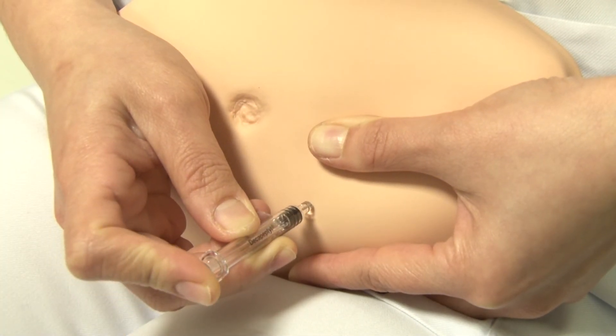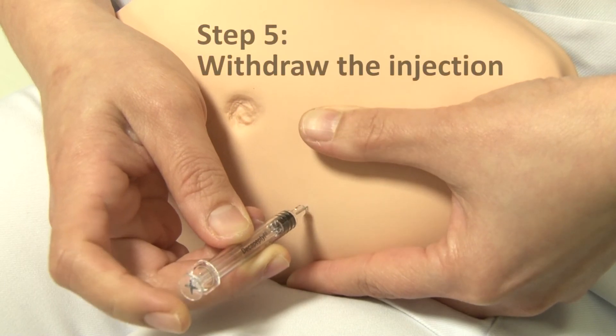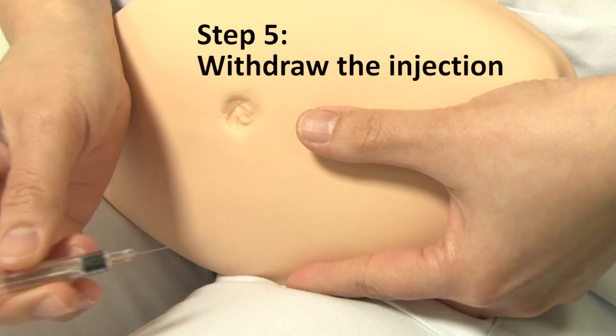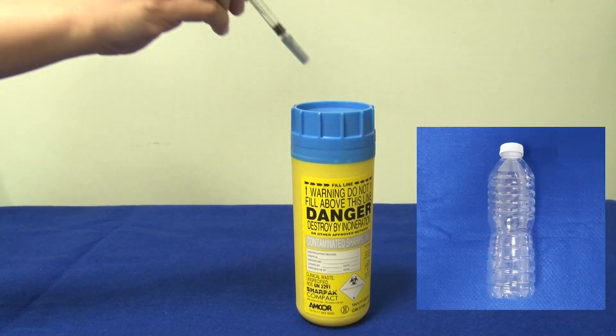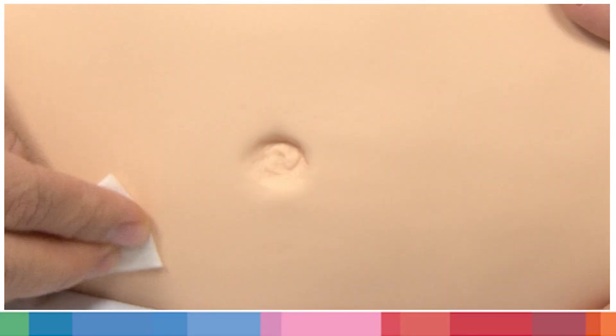Wait for 5 seconds. Step 5: Withdraw the injection and discard it into the disposable container. Use an alcohol swab to apply light pressure and gently wipe the injected site.